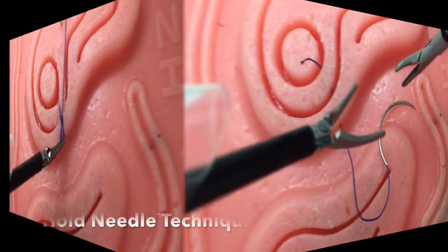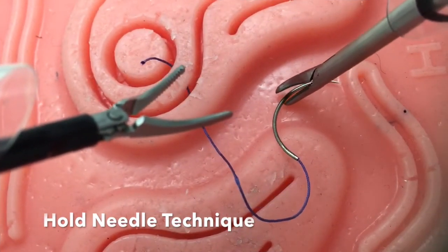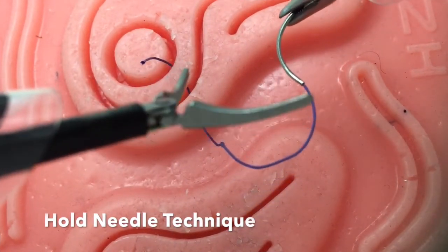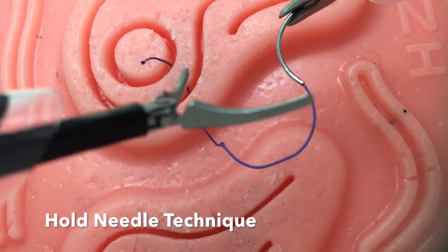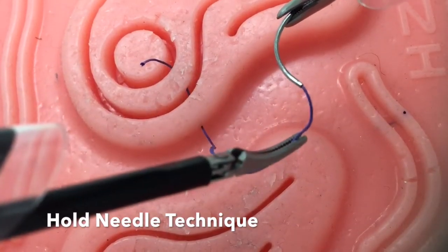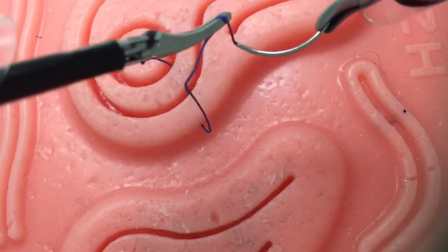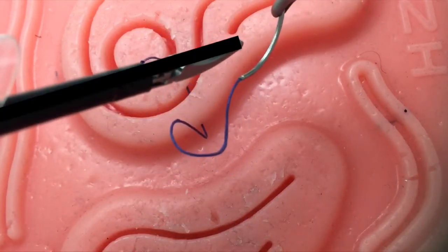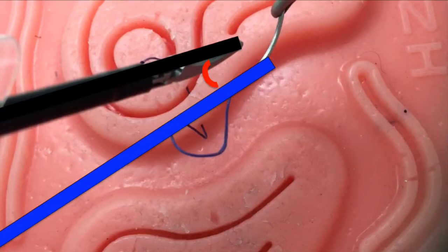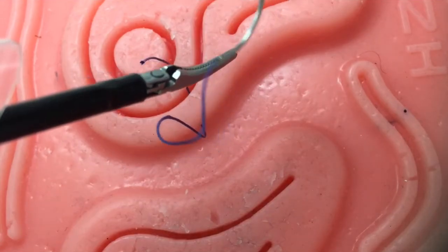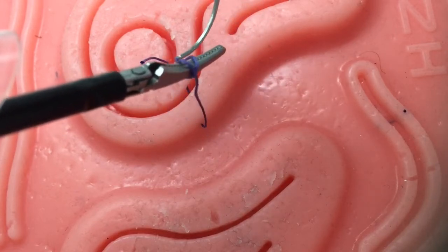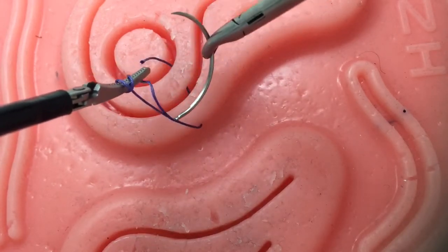The next technique I will discuss is the hold needle technique. This technique may be beneficial with shorter sutures. In contrast to the drop needle technique, here the needle is constantly held. The key principle is to rotate the needle to line with the suture and to again minimize the instrument to suture angle. By creating this almost parallel angle and utilizing the sturdiness of the needle, wrapping your suture around your left instrument becomes virtually effortless.